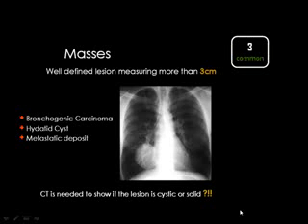Then we have finished with the pulmonary nodule with 6 common possibilities: tuberculoma and hamartoma, smooth margin containing calcium. Bronchogenic carcinoma has a spiculated margin. Hydatid cyst contains water. Arteriovenous malformation has a vascular pedicle. Metastases are multiple, or if it is solitary, you should know the history of the patient of primary malignancy.